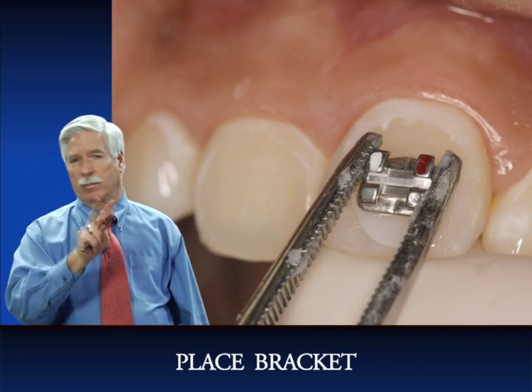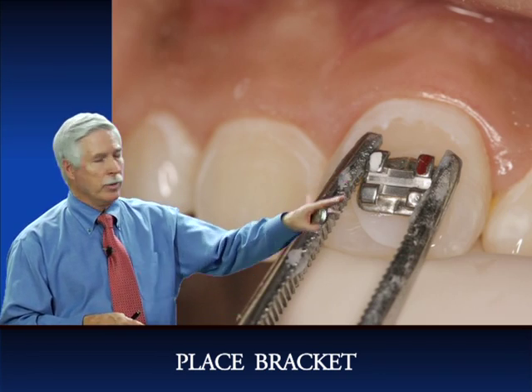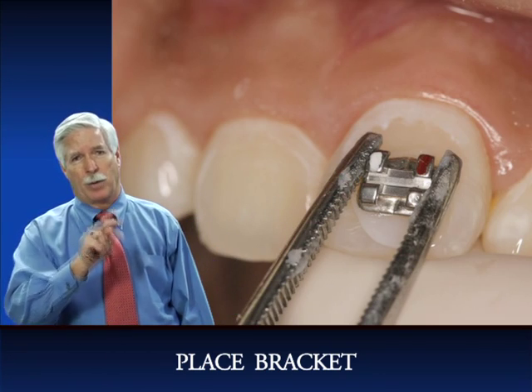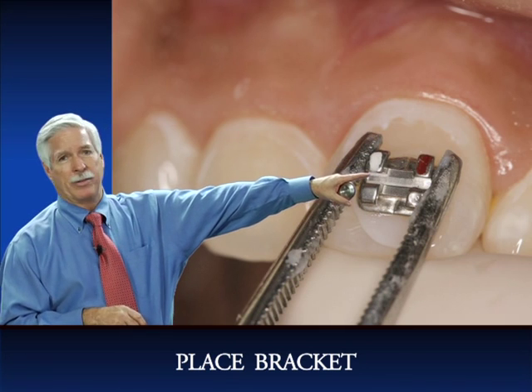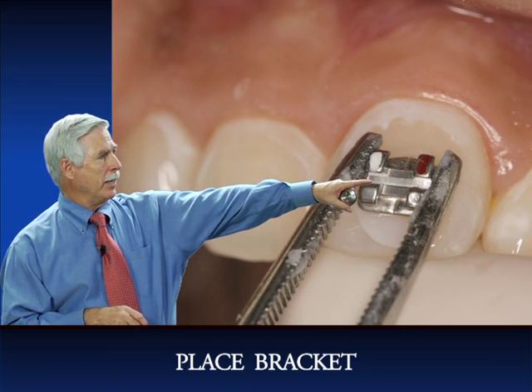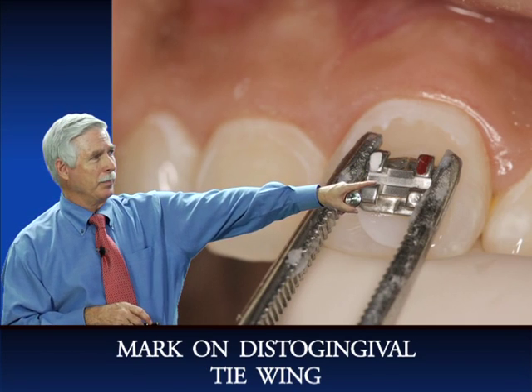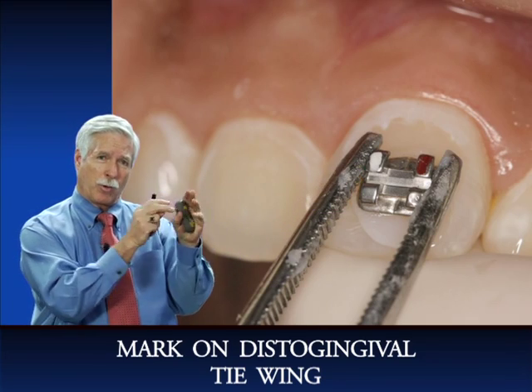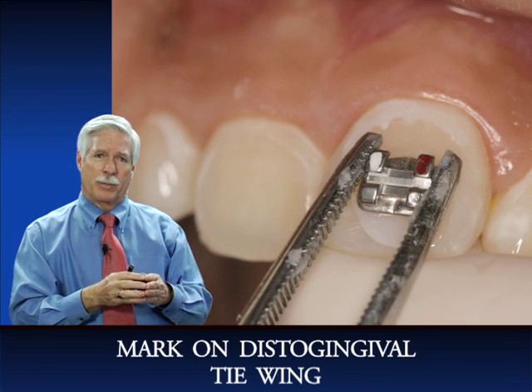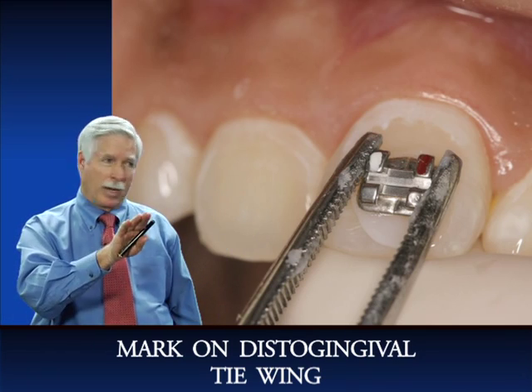Now we're going to use either our bracketing pliers or cotton pliers to place the bracket on the tooth. And you can see the bracket. This is an upper left central incisor, because you've got the red mark on the distal gingival tie wing. And place it carefully on the tooth. We're going to go over the rules of bracket placement in a little while. Push it against the tooth.